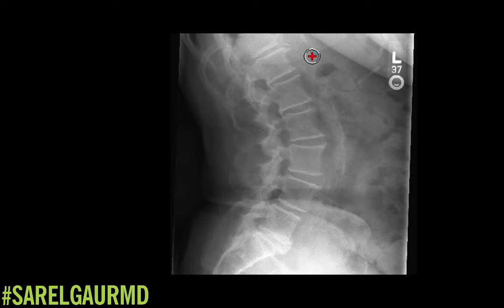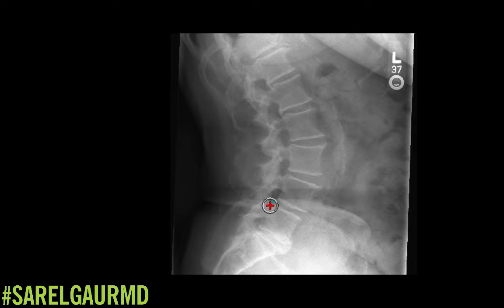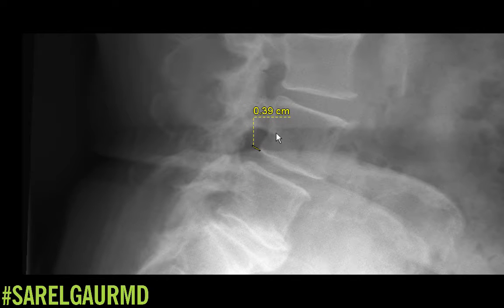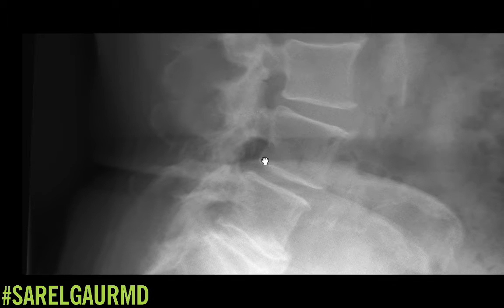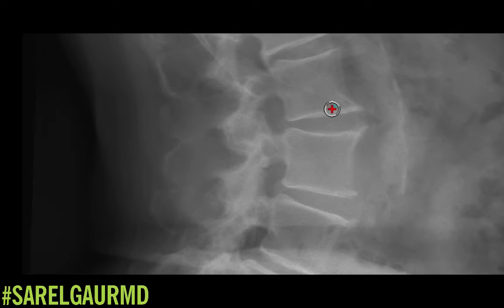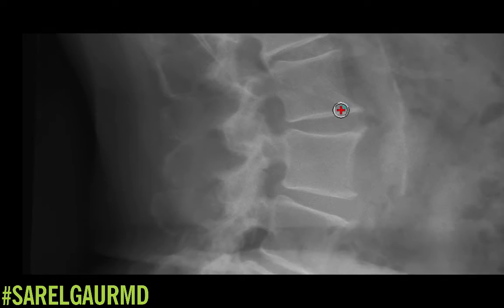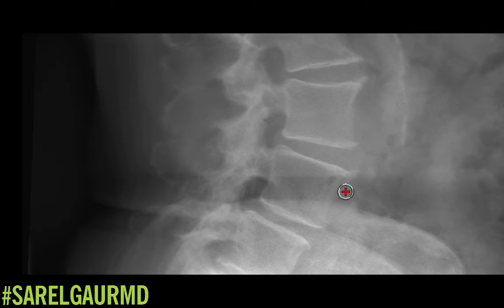First I'm just going to look at the alignment. Looking at the curvature, there's a slight increased exaggeration of the lumbar lordosis — I think that's worth mentioning. Noticing here at L4-L5, there's a minimal anterolisthesis, maybe just about 2 to 3 millimeters of anterolisthesis of L4 on L5. The rest of the vertebral bodies look pretty good for alignment. I am noticing some lipping anteriorly — those are some degenerative changes.